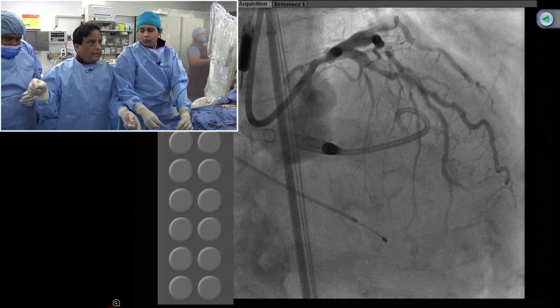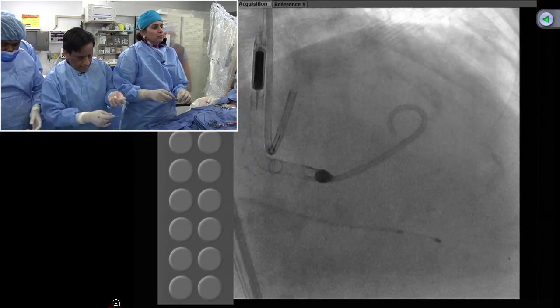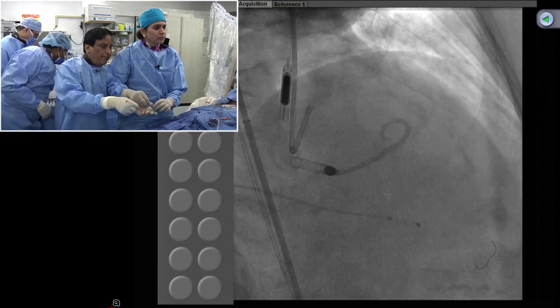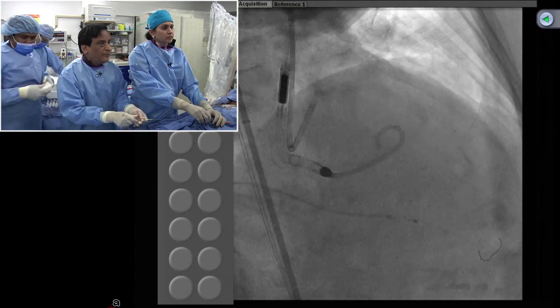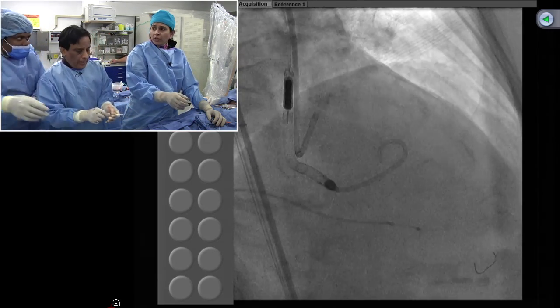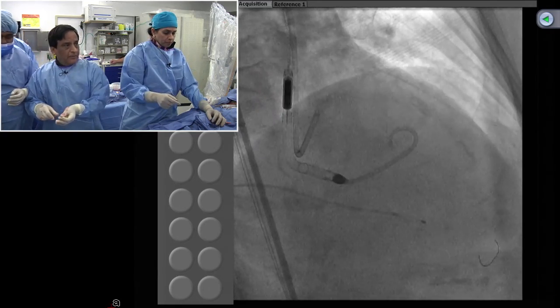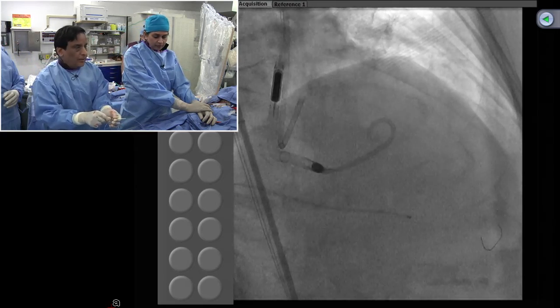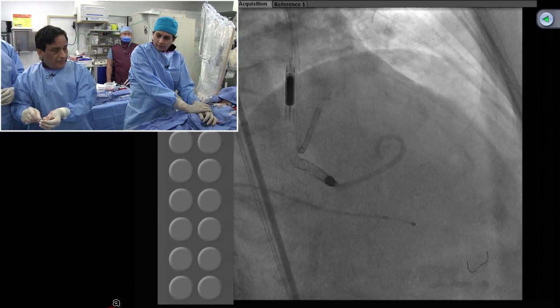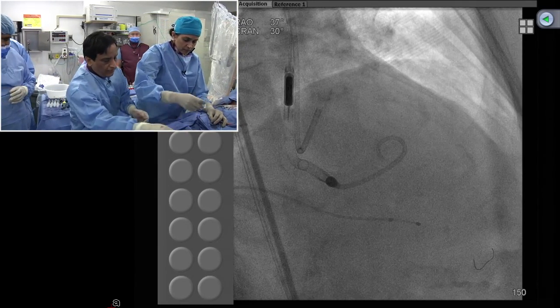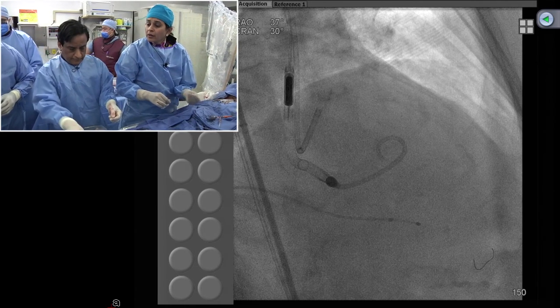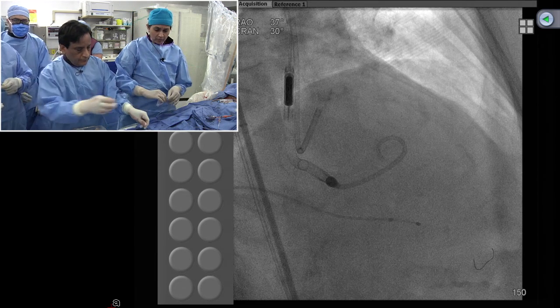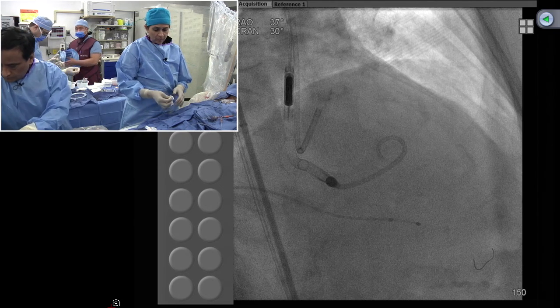The key is discussing the burr size. We have crossed with the rotor wire and the FineCross — we changed to a run-through, and this was very difficult even for the FineCross to go to the mid lesion. Our plan is not to do IVUS at this time because IVUS may not go and would unnecessarily prolong the procedure. We'll do the rota first — plan is 1.25 to 1.5 for the mid LAD and 2.0 for the proximal — then we decide IVUS before or after PTCA. We are ready for a 1.5 burr.